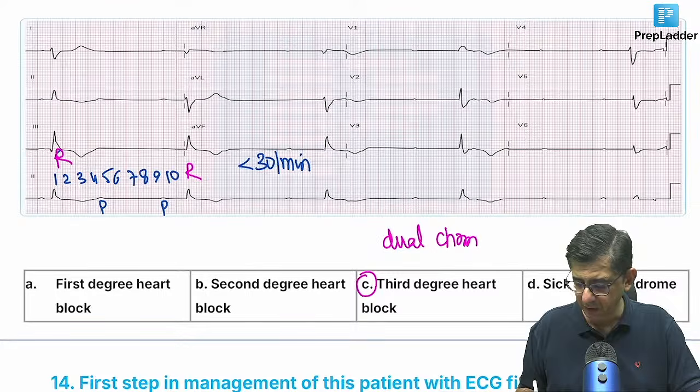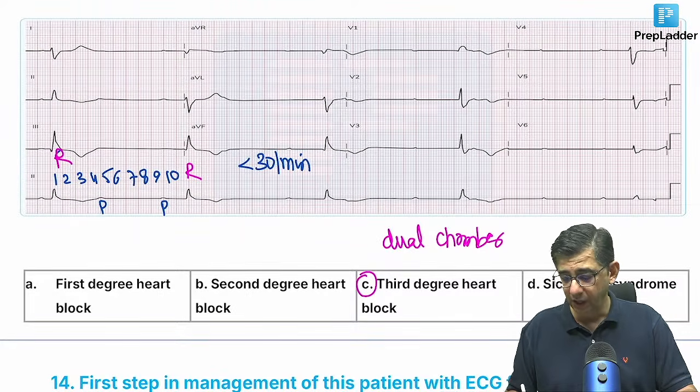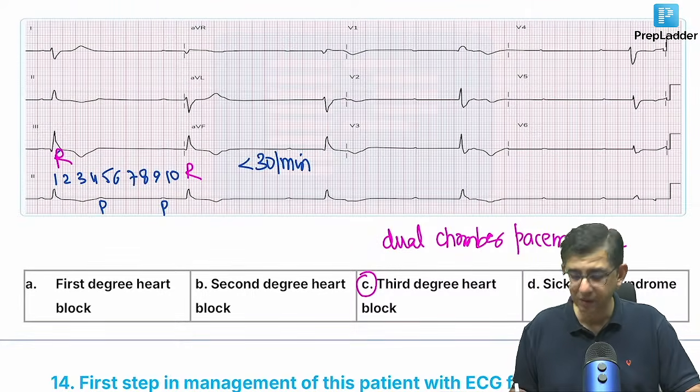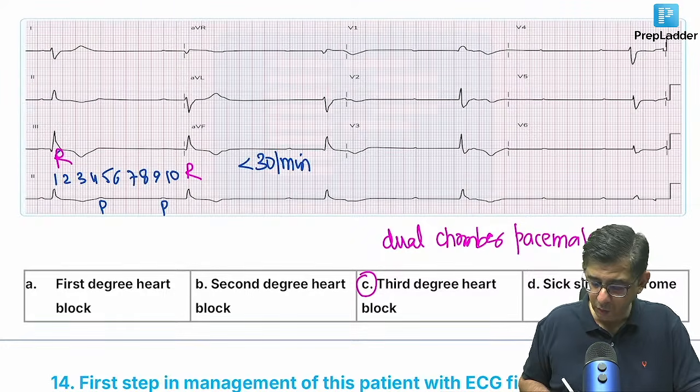जो कि अगेन एक क्वेश्चन था, जो FMG एग्जाम था उसमें उसने डायग्नोसिस वगैरह नहीं पूछा, उसने एक्सरे दे दिया एंड उसने पूछा कि पेशेंट को स्टोक्स एडम सिंड्रोम है और उसमें 2 वायर्स दिखाई दे रही थी, तो उसने बोला कि कौन से वाला पेसर है, तो यू विल से दैट दिस इज अ डुअल चैम्बर पेसमेकर.